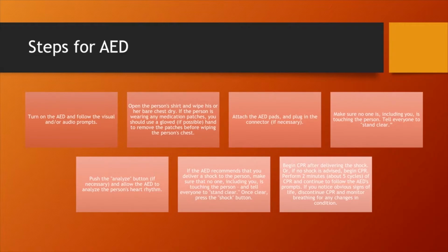The third step is to attach the AED pads and plug in the connector, if necessary. The fourth step is to make sure no one, including you, is touching the person. Tell everyone to stand clear.